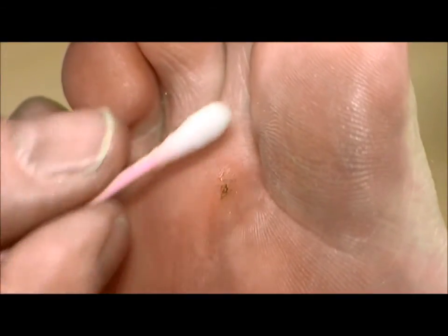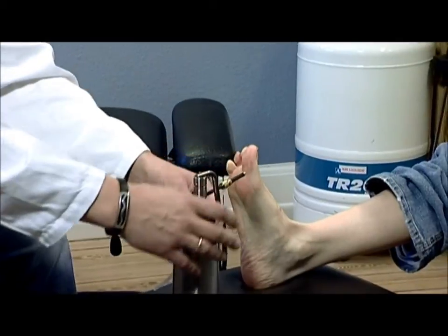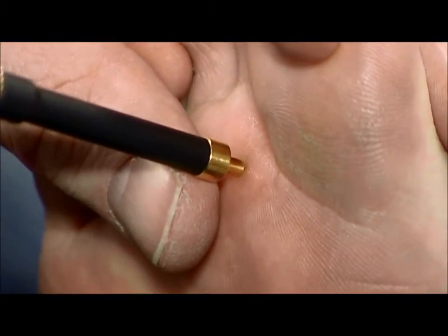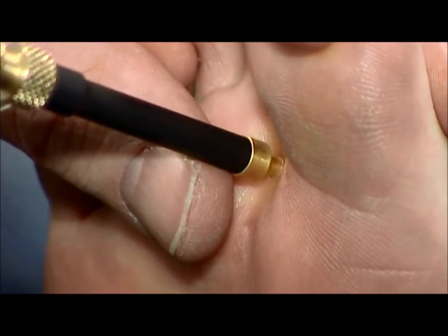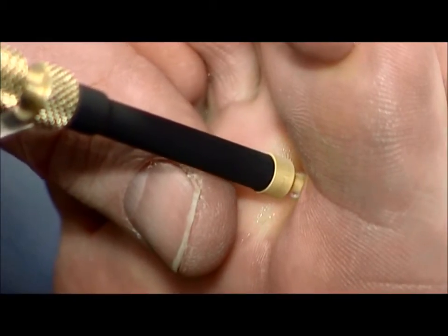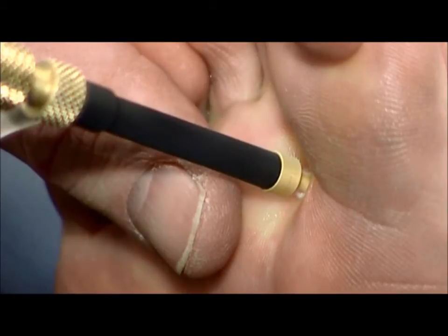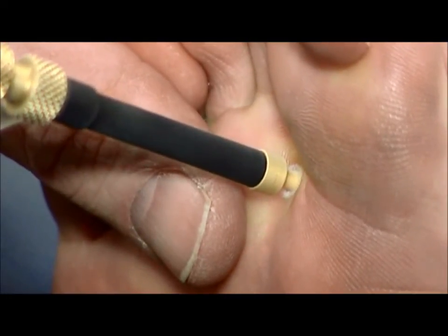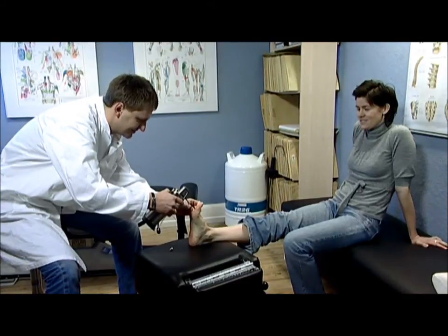Moisturize the treatment site with a drop of gel or a cotton bud soaked in water, then apply the probe while it is still warm without pulling the trigger. With the probe in place, pull the trigger. After a few seconds the probe adheres to the skin, ensuring optimal skin contact and heat transfer. Keep freezing until a one millimeter frozen halo is seen around the probe.